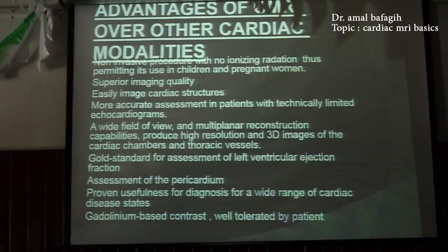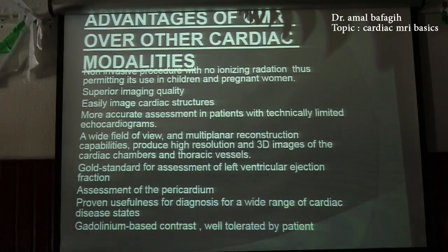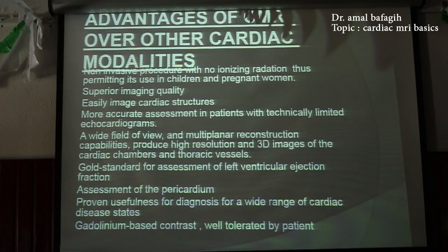Pregnant women. It has a superior imaging quality compared to echocardiogram, easily imaging of cardiac structures which may be obscured by fat, bone, gas, etc. More accurate assessment in patients with technically limited echocardiogram, wide field of view, multiplanar reconstruction capabilities, produces high resolution 3D images of heart and great vessels.